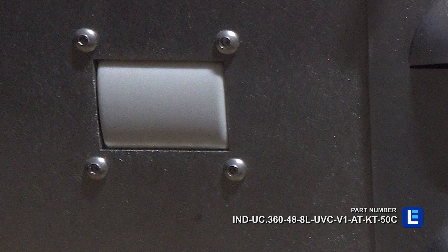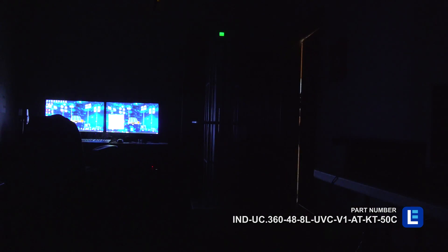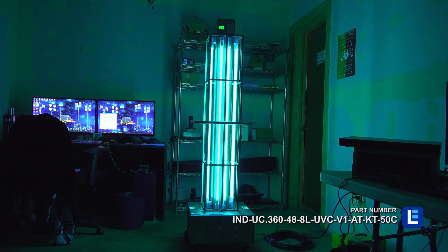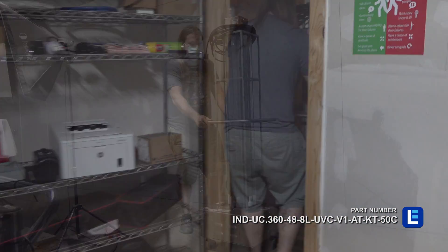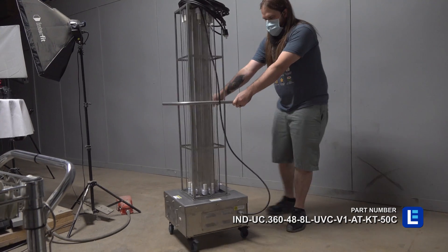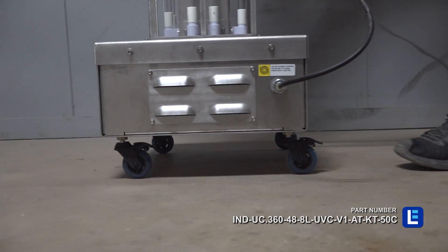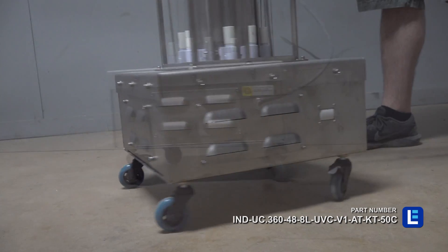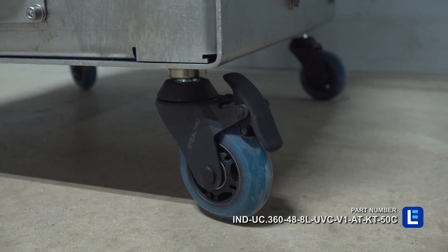The cart also has a built-in motion sensor that will shut the lights off when motion is detected. The light will resume cleaning after no motion has been detected for 30 seconds. Operators may move the cart around after exposure time to disinfect several locations. The roller blade style wheels allow for ultra smooth movement, and each wheel includes a lock to lock the unit into position.